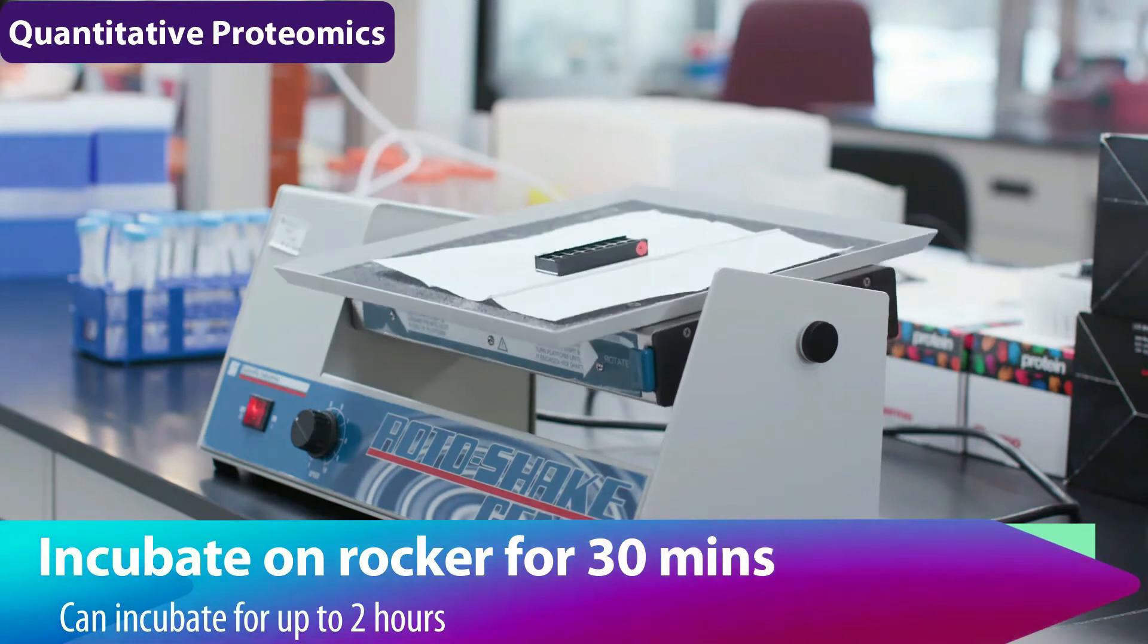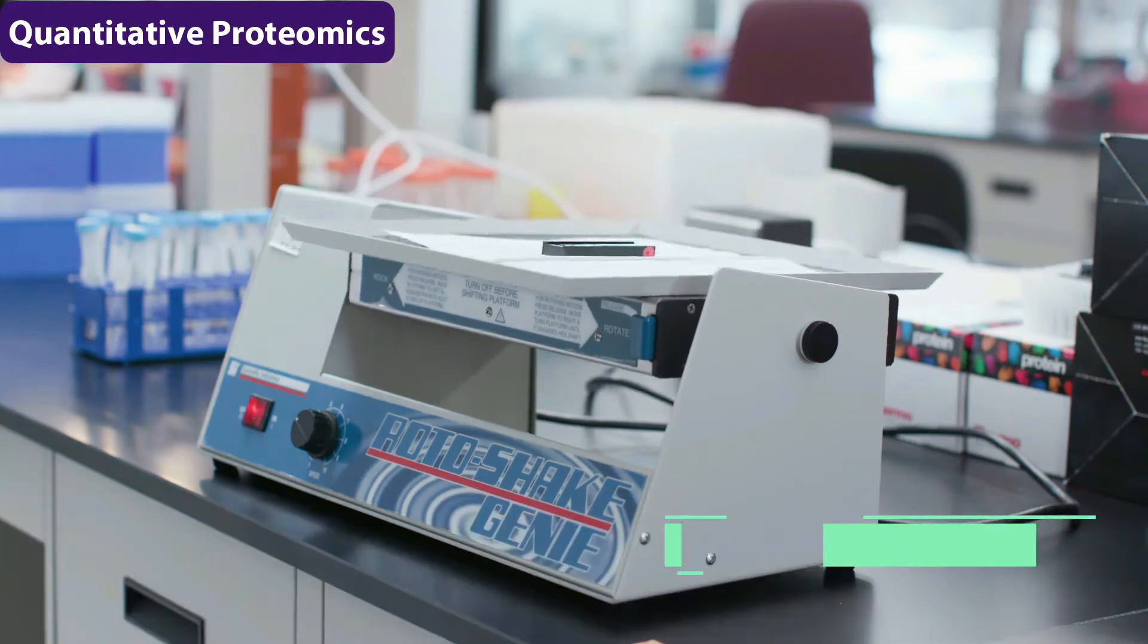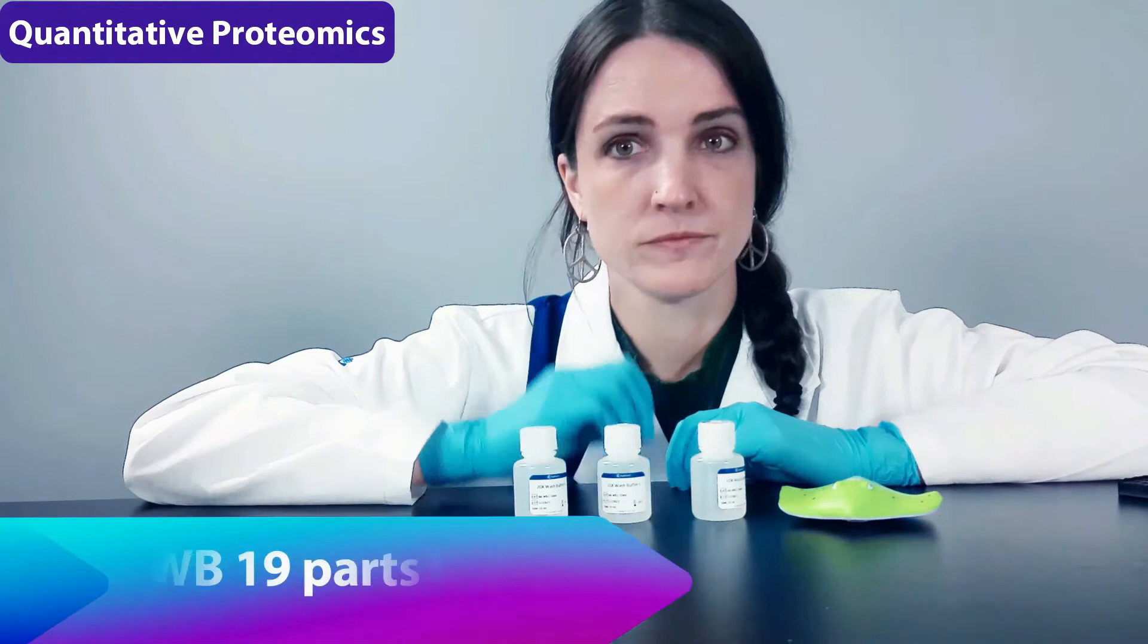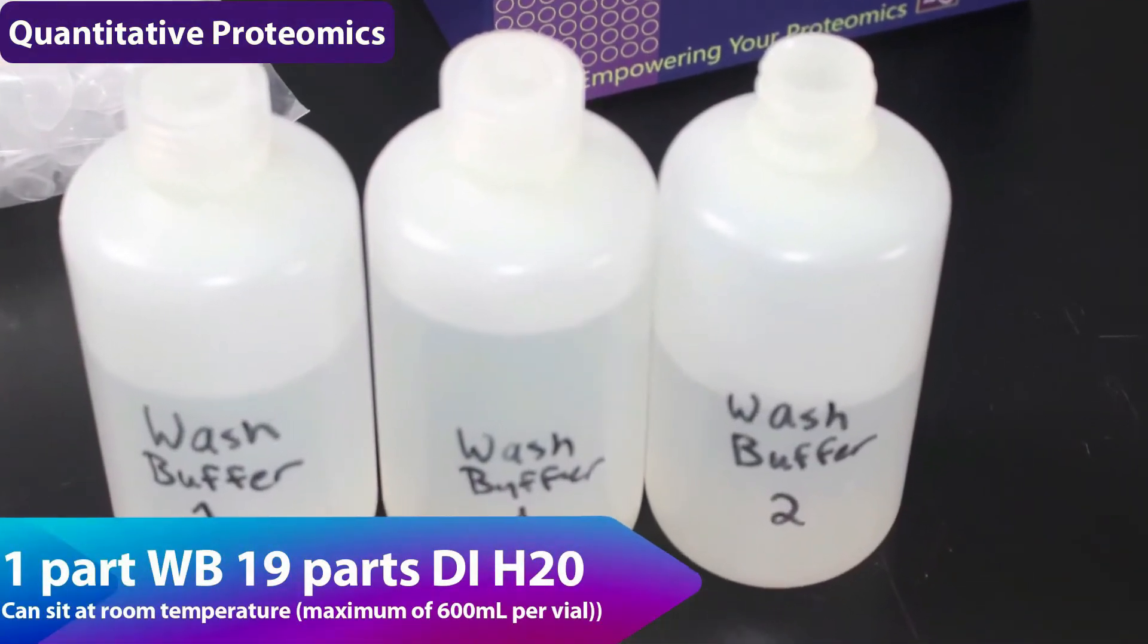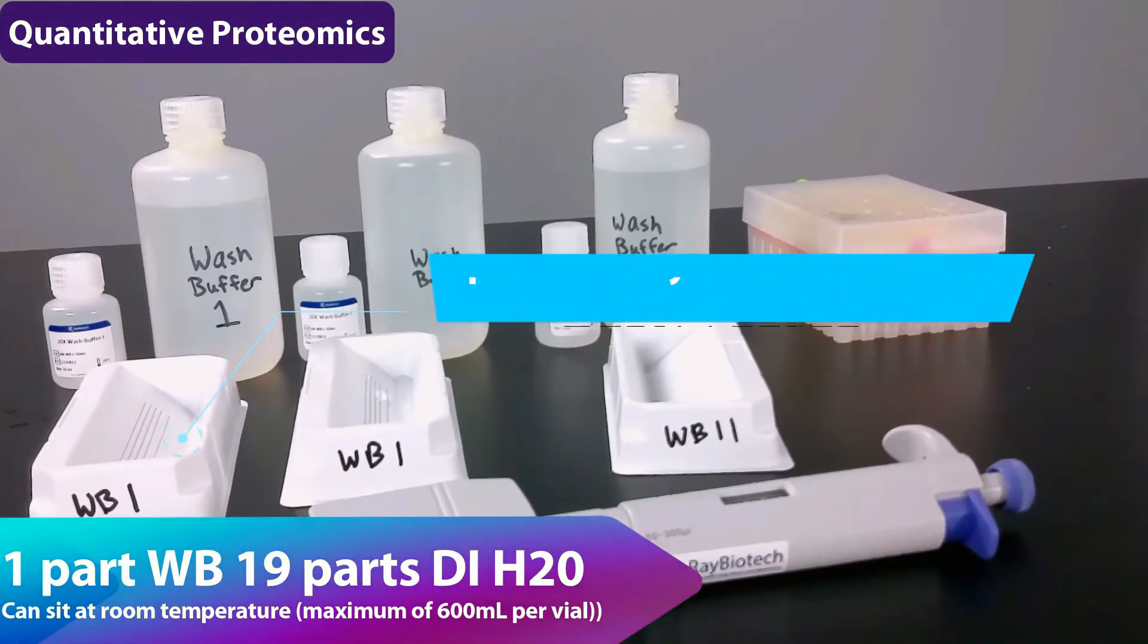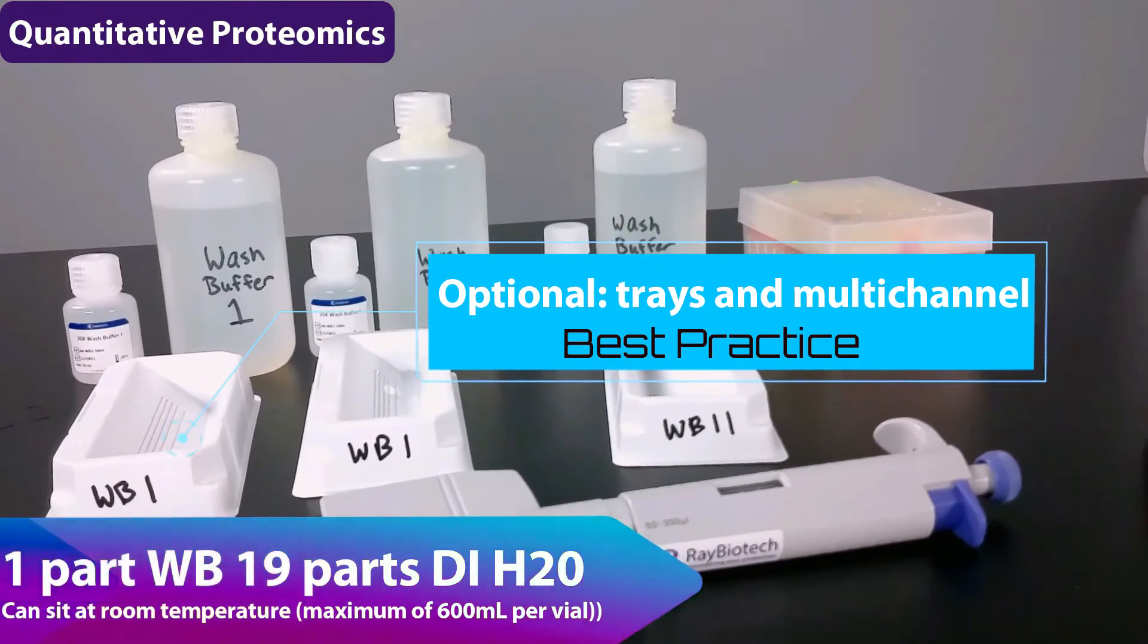While that is incubating, we're going to prepare our reagents. So first is going to be the three wash buffers. That's going to be one part wash buffer and 19 parts deionized water. The easiest way to use these wash buffers is with trays and a multi-channel.